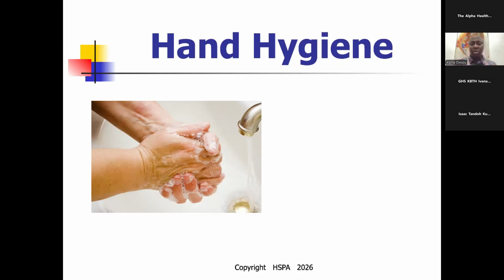If you don't want to wear the gloves, and somebody will say, when I wear the gloves I'm not able to handle the instruments very well, I'm not able to inspect it. And some people wear gloves and they get allergic reactions. Yes, we get all that. If you want to go bare hand, you have to wash your hands. You wash in, wash out.